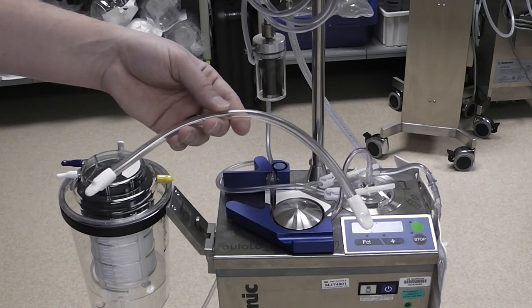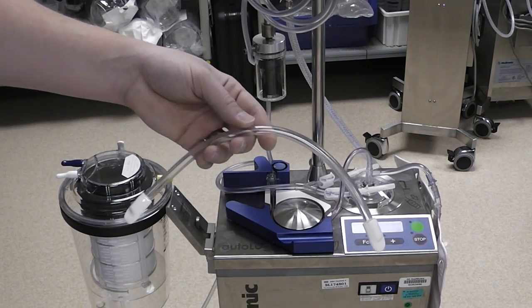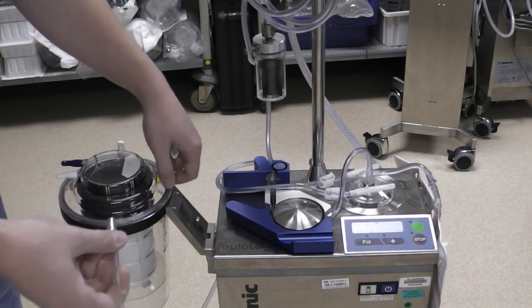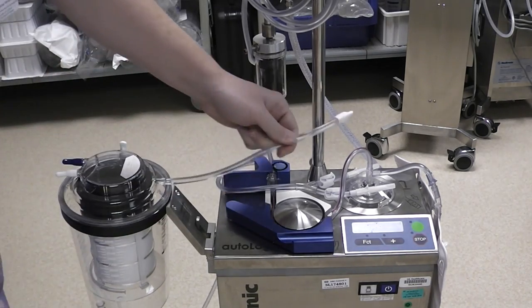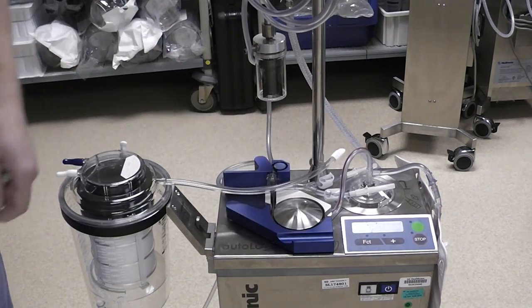Next you want to find this short piece of quarter inch tubing with the two white caps on the ends from your pump pack. You are going to remove one cap from one side, the yellow cap from this side of the reservoir, put that on, and then just leave the rest of it with this cap still on it on top of the cell saver.